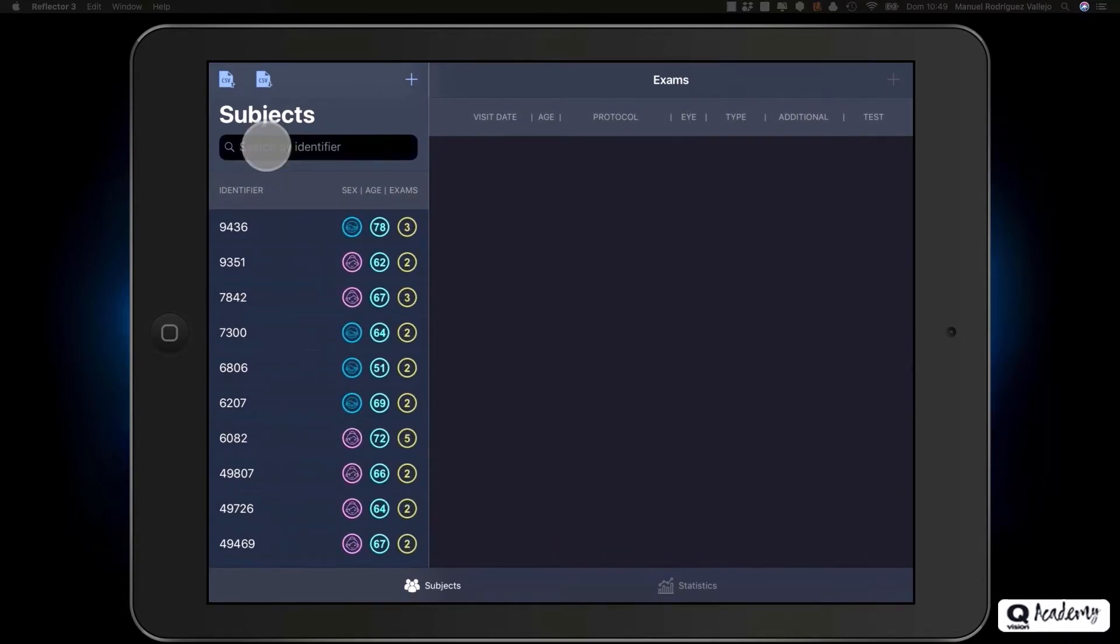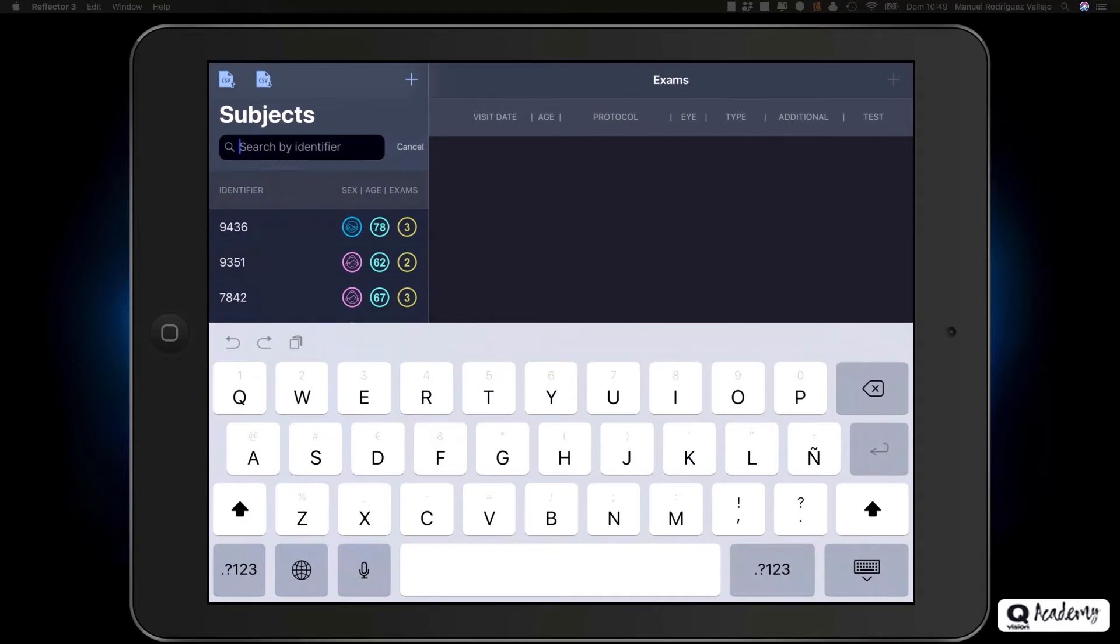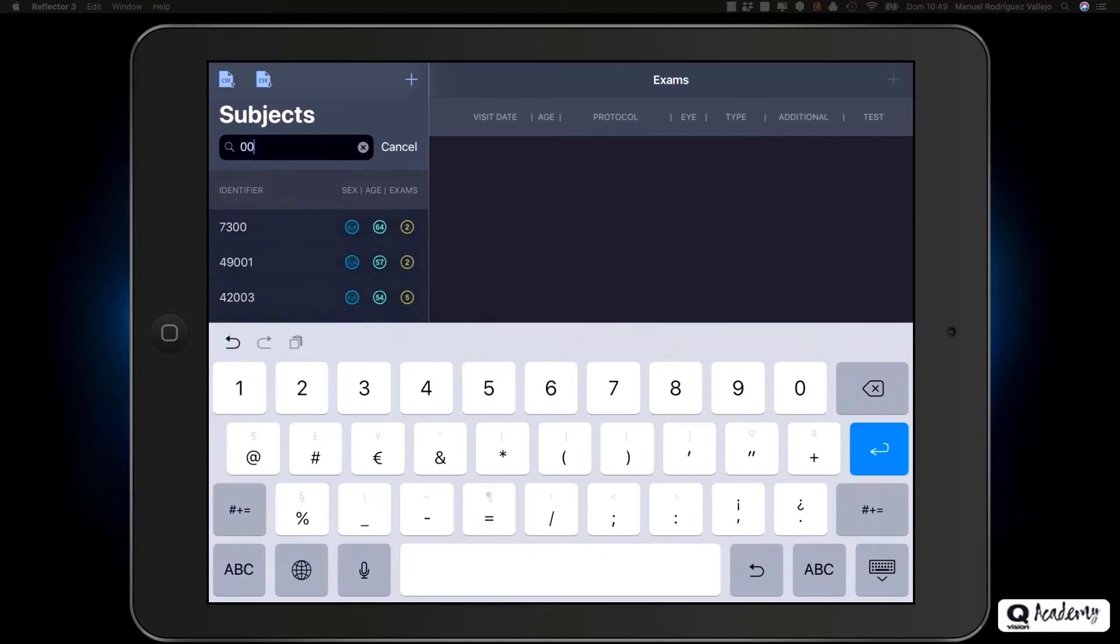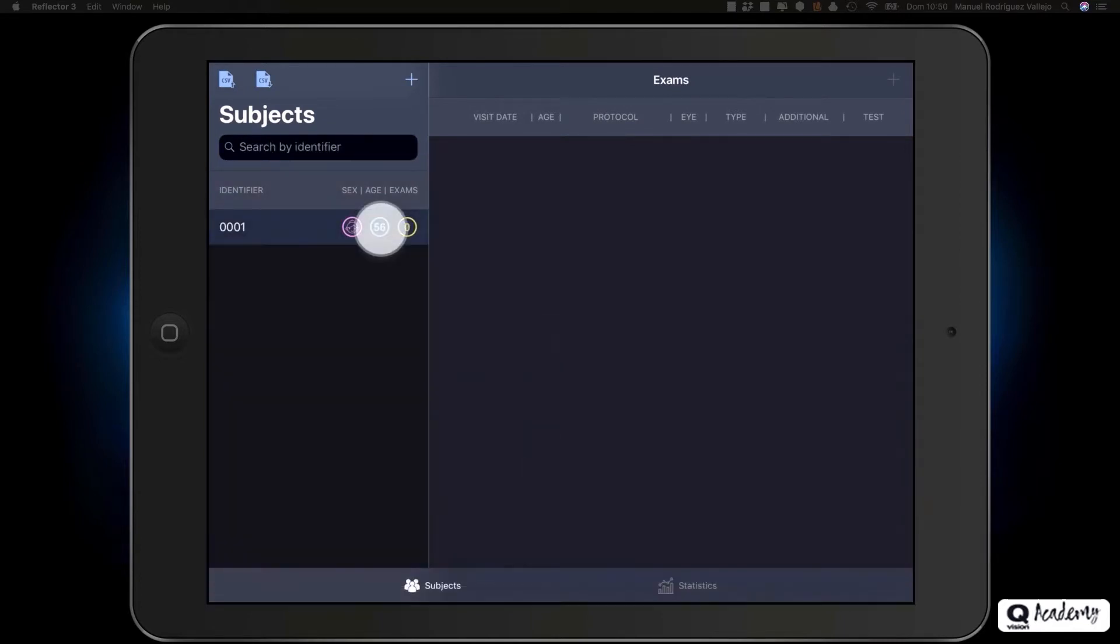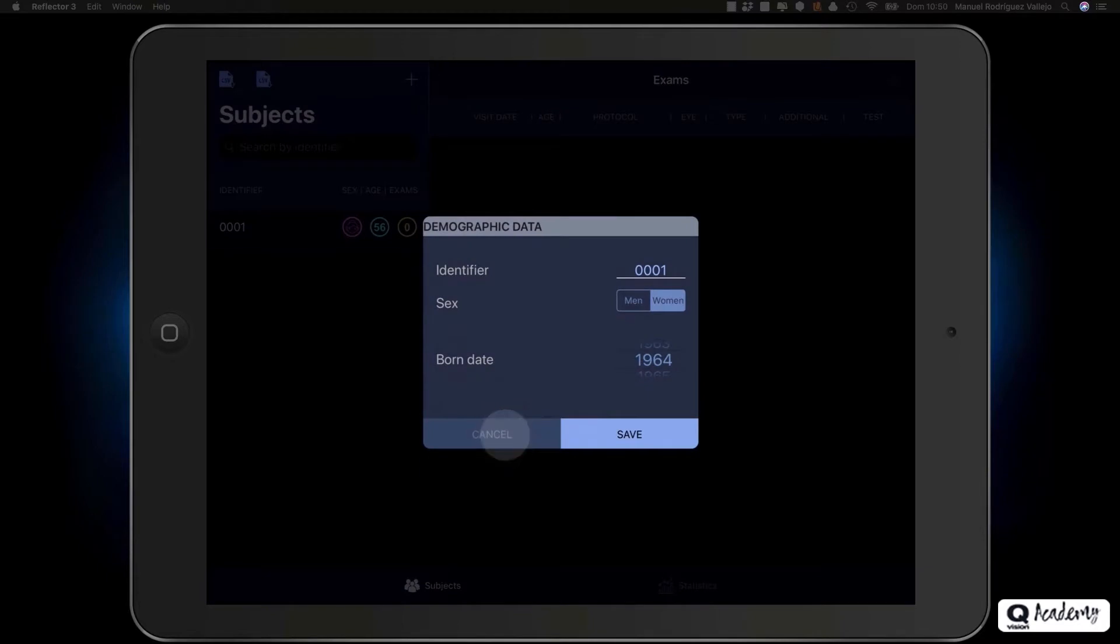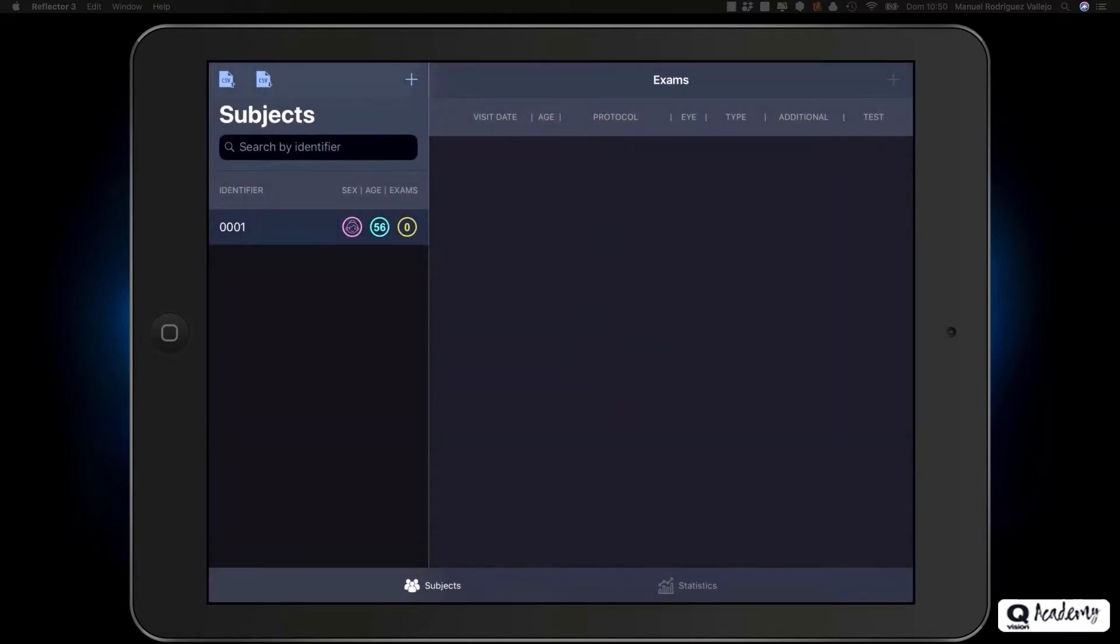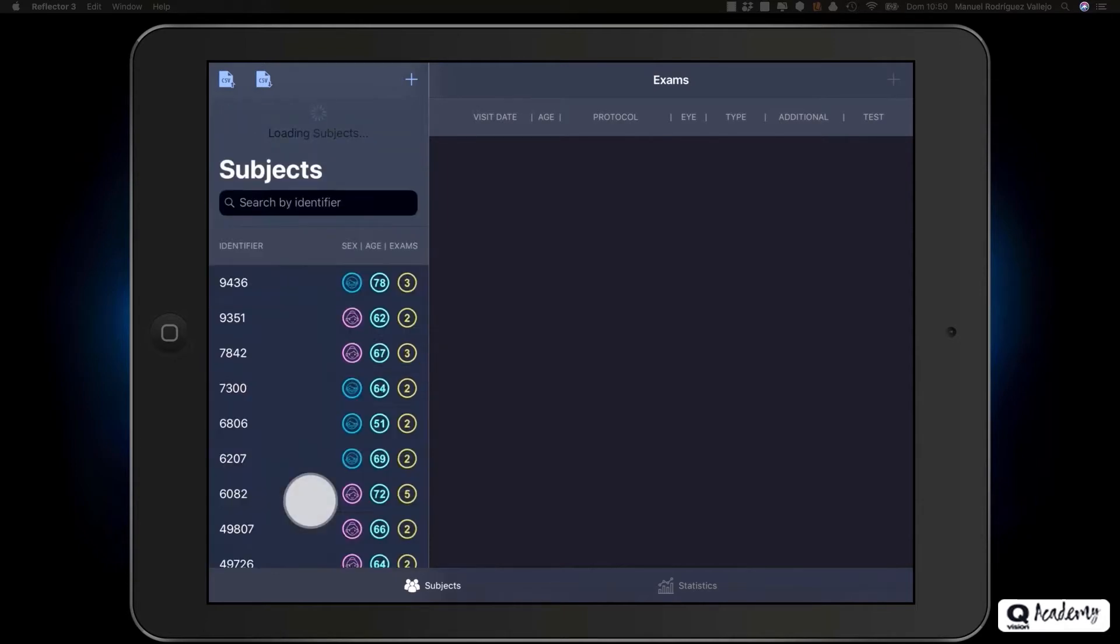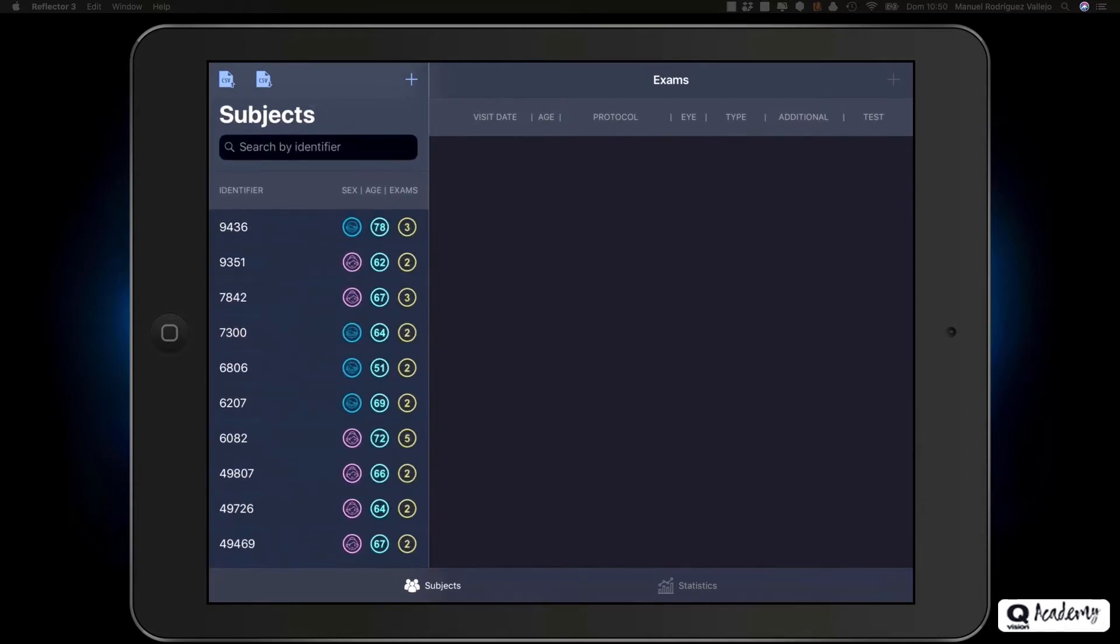You can use the search engine to search for a subject within the list of subjects. At any time, you can go back to edit the subject data by clicking on the age, gender or number of exams icons. To view all subjects again, simply slide your finger over the list of subjects.